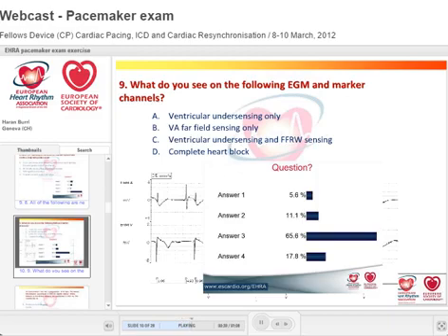Let me just check here, for instance. You have a ventricular beat that's being actually sensed far field in the atrial channel with relatively high far field R wave. So this is something which at device implantation you should always look out for when you place the atrial lead. Look out for these high amplitude far field R waves because you really don't want to have them. They'll lead to all sorts of problems later on. We spoke a little bit about that earlier on today.